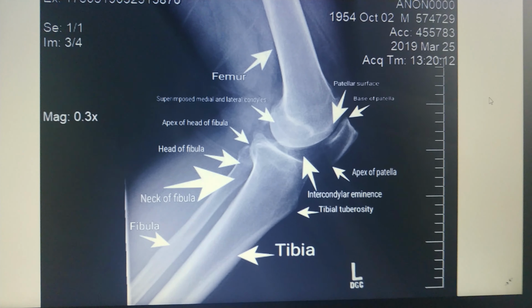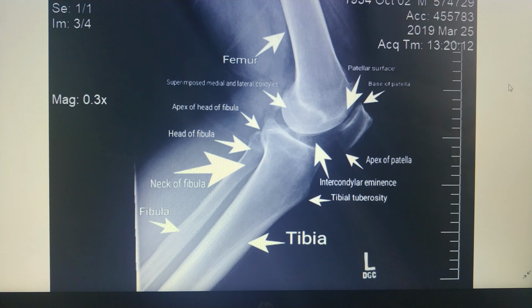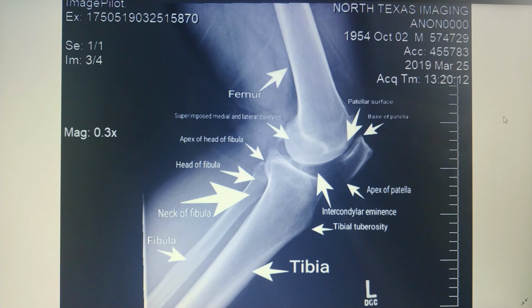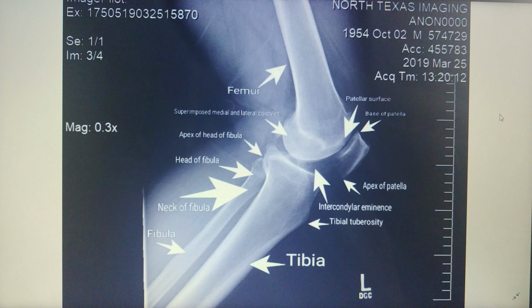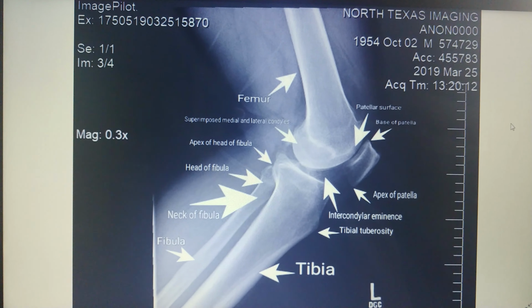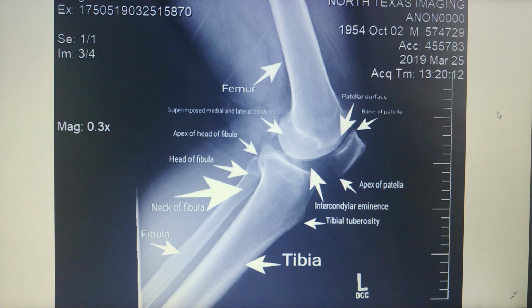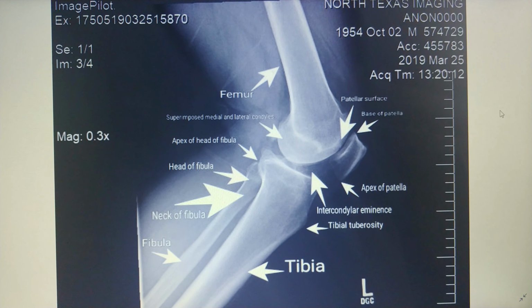Another thing that I indicated on my paper that I didn't entirely agree with, or think that could have been better, I should say, was leaving the jeans on during the X-rays. In this particular location, traffic flow is pretty busy, and if we had to ask every patient who we had to do lateral knees and remove their jeans, it would just back up traffic tremendously. And while sometimes that's worth the trade-off at this point, according to the techs that I work with and the radiologist that's present at the location, we don't need necessarily to ask every patient to remove the jeans unless it's absolutely necessary, depending on maybe the texture of their jeans. In this case, they said no, all was good, and we can just go ahead and do right through jeans. So that's what I went ahead and did.